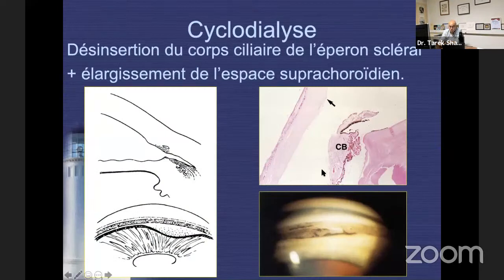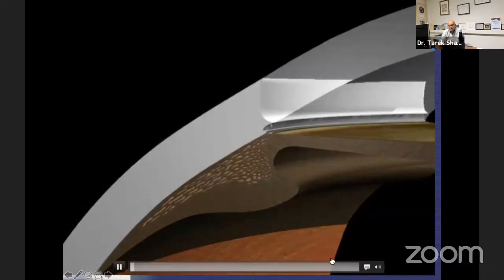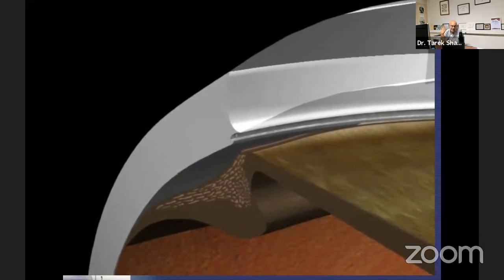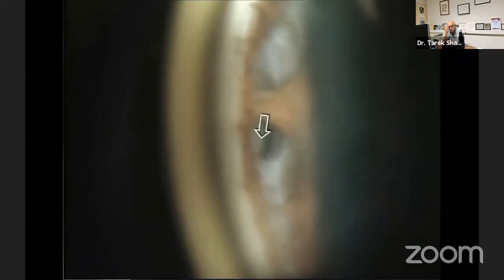Cyclodialysis is also something we need to identify. These cases are usually associated with hypotony — the ciliary body and choroid detach, giving direct access for aqueous into the suprachoroidal space. Clefts are usually small, not large, taking maybe 10 degrees of the angle, not 90 degrees. Here is another case of a ciliary-choroidal cleft — oval-shaped openings of limited extent.